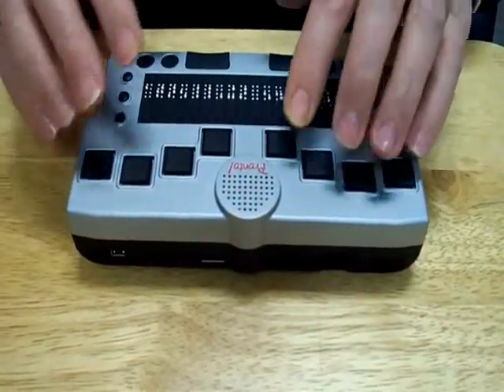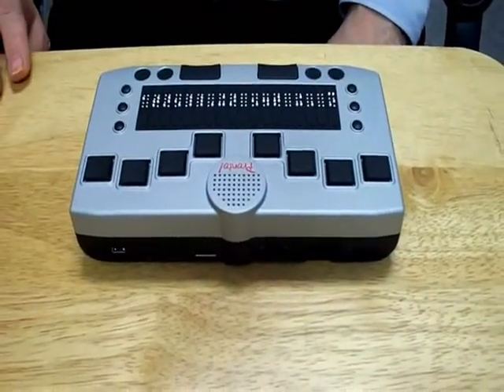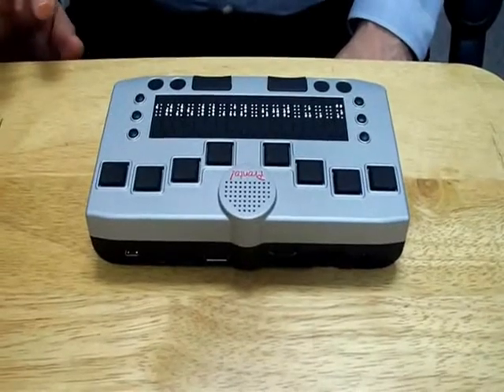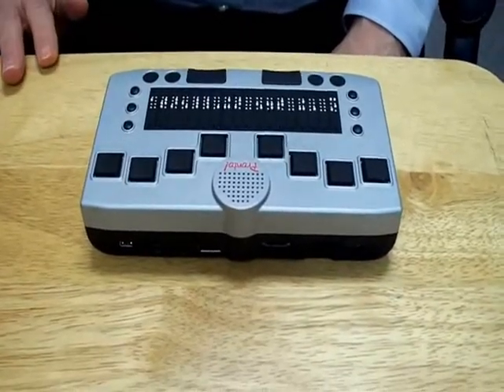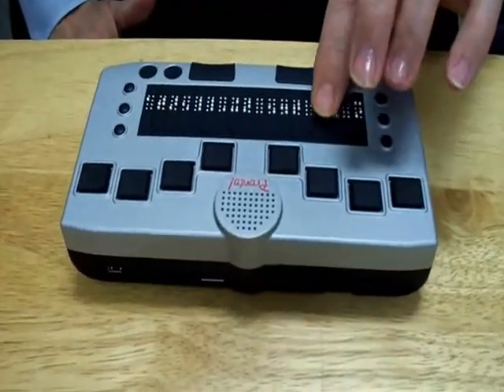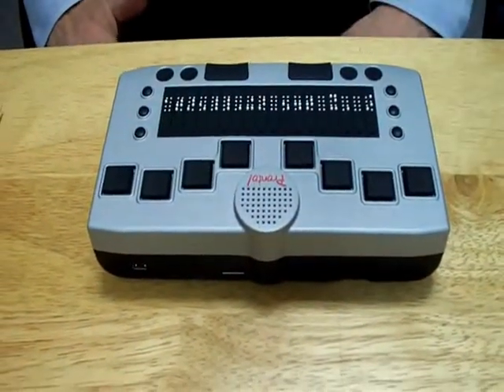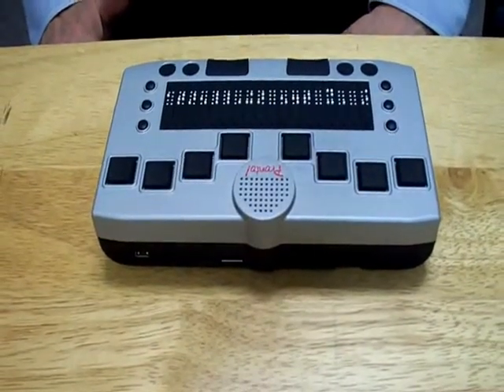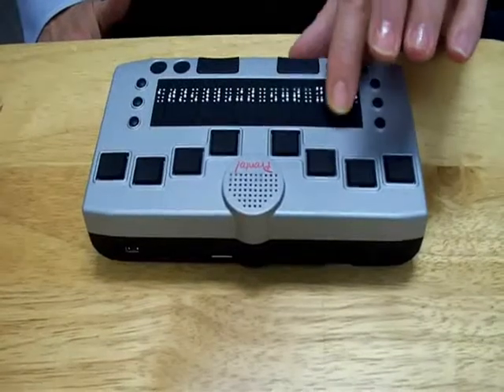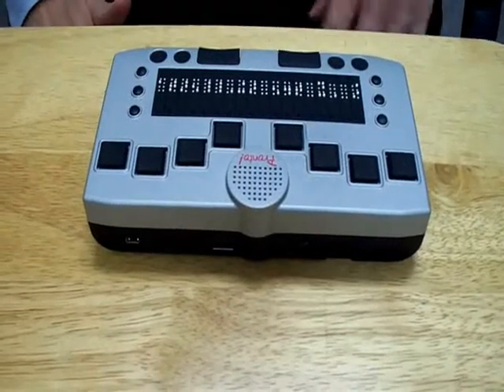And now moving down from the Braille keys, we have the Braille display. And it's an 18-character display. Above each character is a button, and that's a router key. If you want the cursor to come to that particular letter, just press the button above it. M. I brought it to the letter M. Also, when you're in a menu and you want something to execute, you could hit any one of these router buttons on the Braille line and have that particular thing executed.